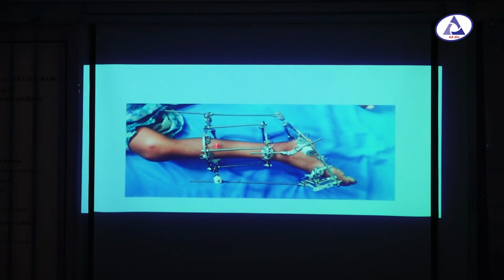And this is the medial side view of the clinical photo of the patient. These are the two rings in the leg, and this is the U ring, and this is the hinge in the medial side, and this is the posterior rod. This will be lengthened gradually, and this is the anterior rod. This is shortened gradually, and the procedure is 1 millimeter lengthening or shortening per day, and it is divided into 4 parts. That means only 0.25 millimeter every 6 hours. So gradual and very slow correction of the deformity gives the patient painless correction of the foot.